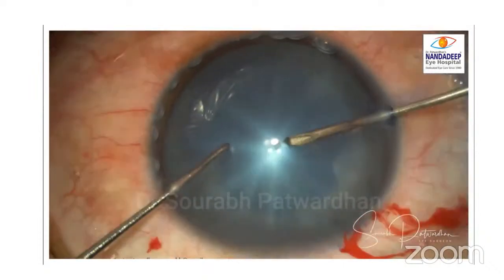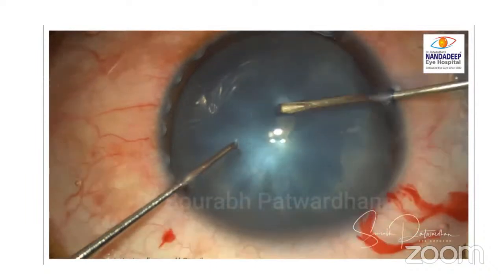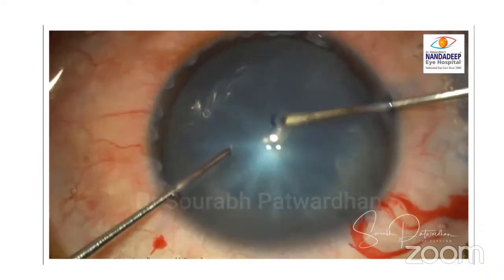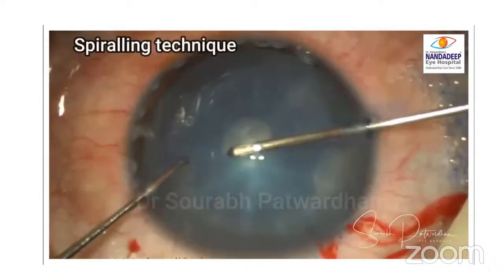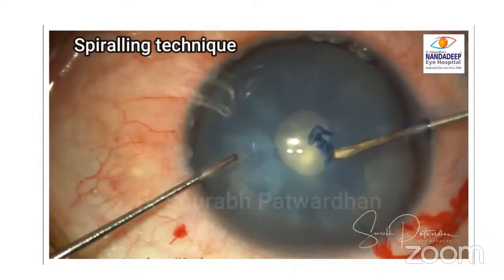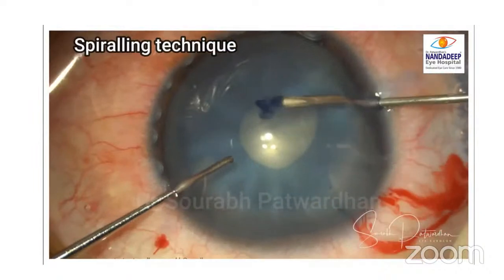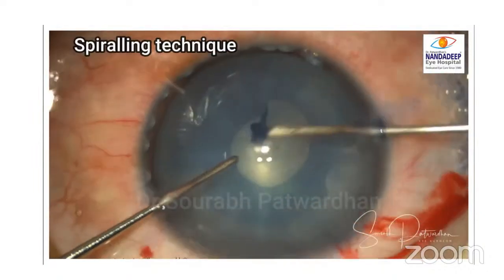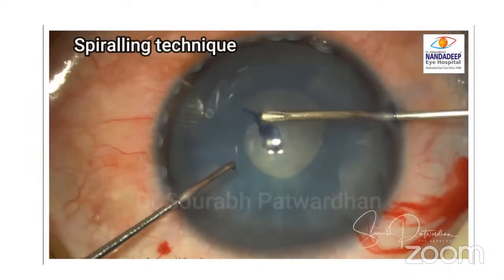Even if you cannot see, make sure that you have the posterior segment surgeon ready in case there is a tear and oil starts spilling out. Once the antechamber is filled with hylucoat, which is a combination of chondroitin and hyaluronate, you start with the spiraling technique.